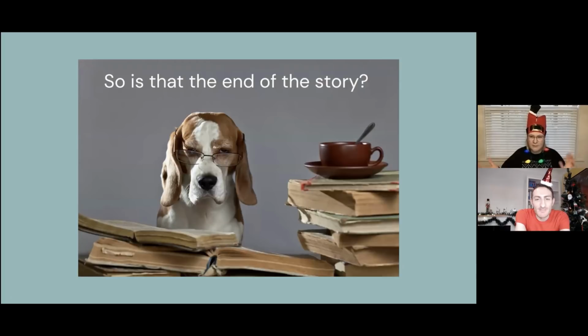So why would I show this case if that was it? That's not the end of the story, right? So this dog had lymphoma, but I personally look at all of the lymph nodes submitted when there are multiple lymph nodes submitted, even if I already have a diagnosis. I had other lymph nodes to look at, and I didn't want to ignore those. So even if I'm just popping them up on the microscope and doing a quick scan to make sure that it also looks like lymphoma and there's not anything else lurking in there, I'll do that because I just don't want to miss anything.